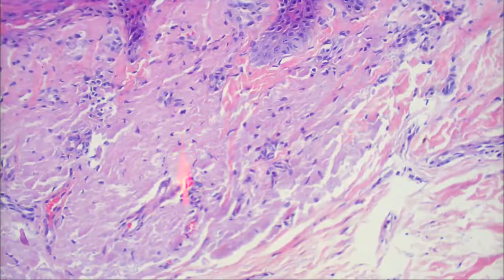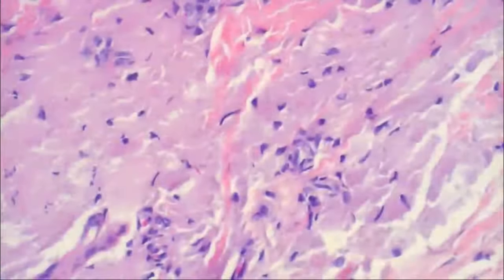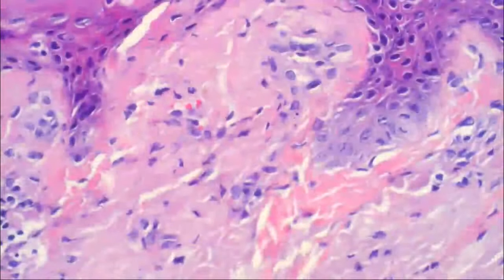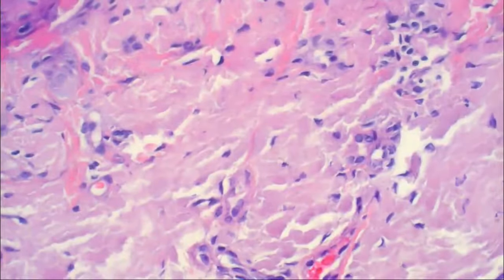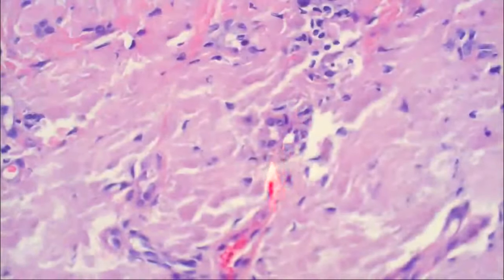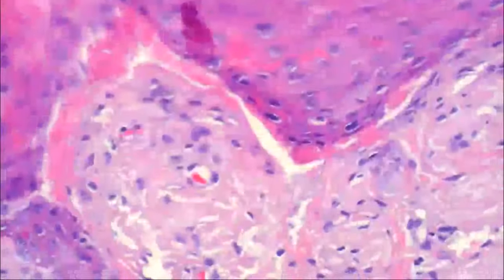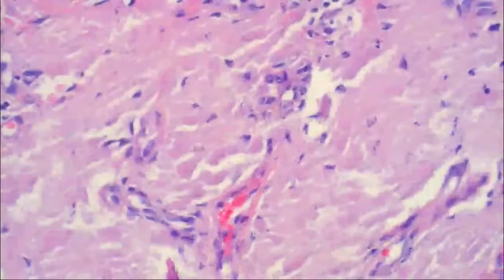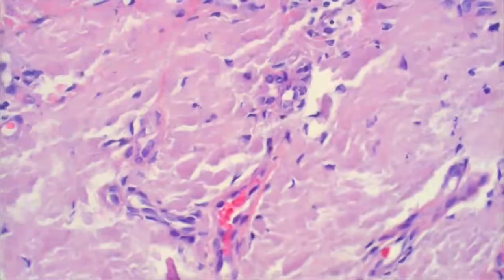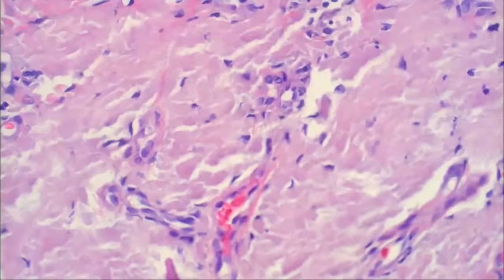Yeah, when I saw the clefts, I thought amyloid. Do you still think amyloid? I am not sure about the final diagnosis on this, but that's what I thought initially when I saw the clefts. But I didn't recall amyloid being so cellular. Well, these cells are probably background cells, a blood vessel right there, and maybe some fibroblasts, that just happen to be sitting there in the dermis. So if something gets deposited, depending on how much of it gets deposited, it may or may not replace everything that's there. It may just intercalate between some of the pre-existing things that are there to begin with. Okay, then I will stick with amyloid.